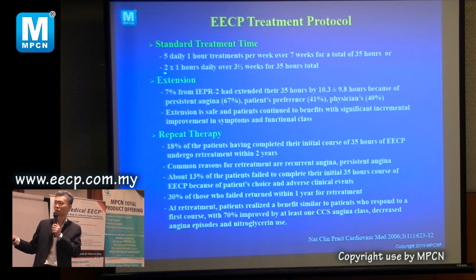Sometimes you can do 2 hours every day for 3.5 weeks. That one I'm not sure, but this is the standard protocol. Based on the studies, some patients can complete this, and some of these patients have to repeat it because they have persistent angina. Some patients improve, but some of them still have symptoms. They come back and do more, and sometimes the doctor and the patient will ask to do more, and it's quite safe to do it.